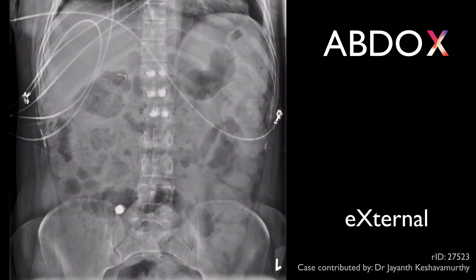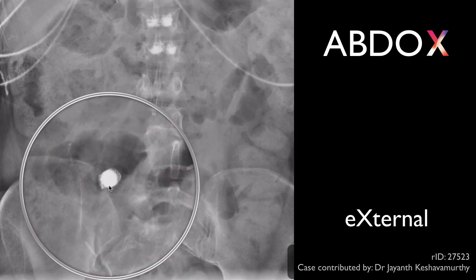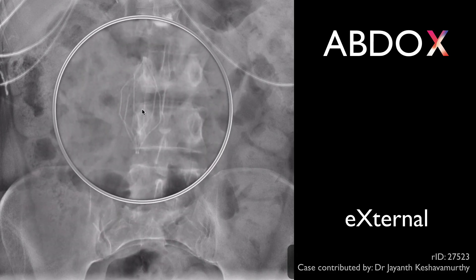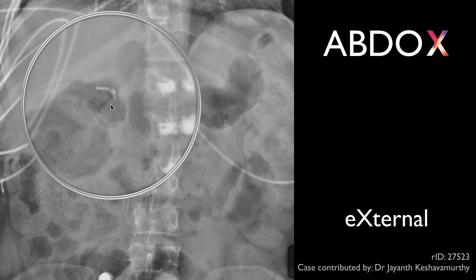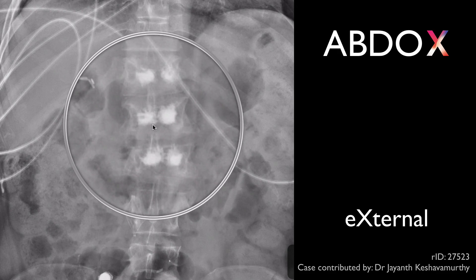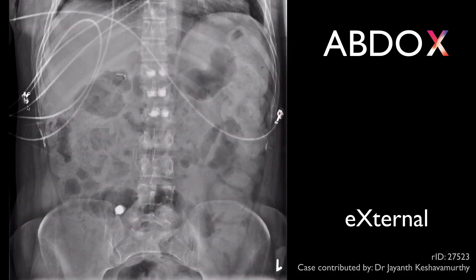X is for external objects, foreign bodies, lines, and tubes. Several such items can be seen here. This rounded object is a capsule endoscope within the small bowel. This is an IVC filter. These are cholecystectomy clips. These areas of high density indicate cement within vertebral bodies from a previous vertebroplasty. And these are cardiac monitoring leads.